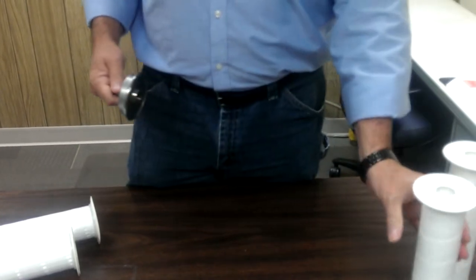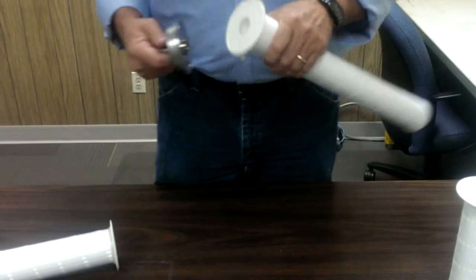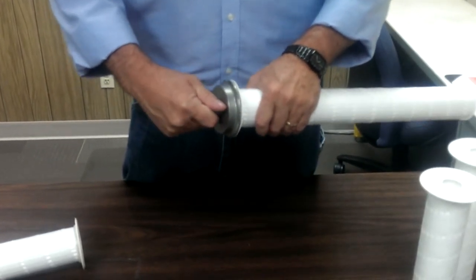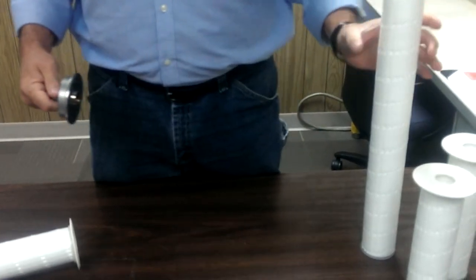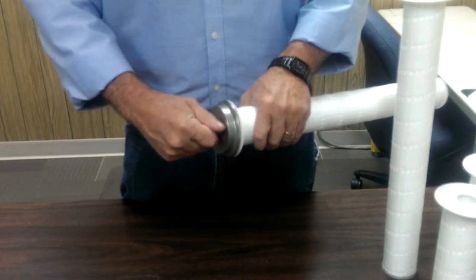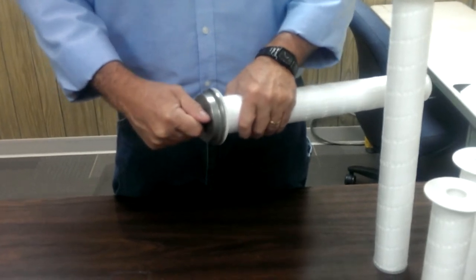Another bad filter — does not insert completely. Bad filter. Does not insert completely. Bad filter.